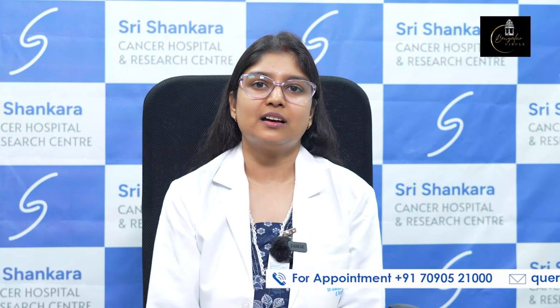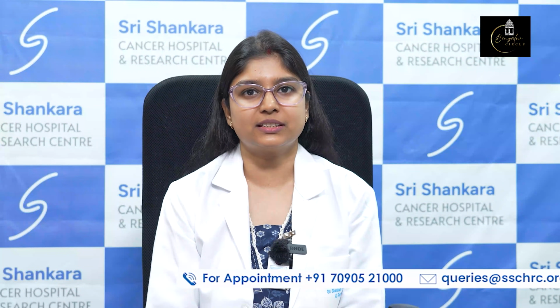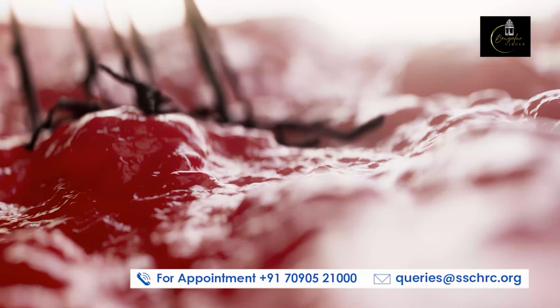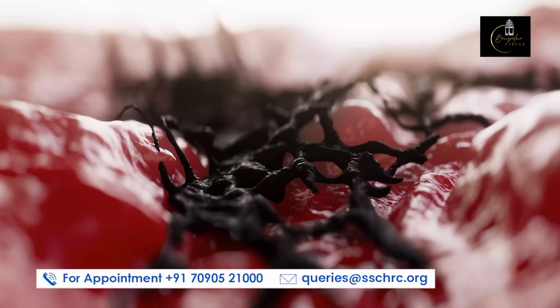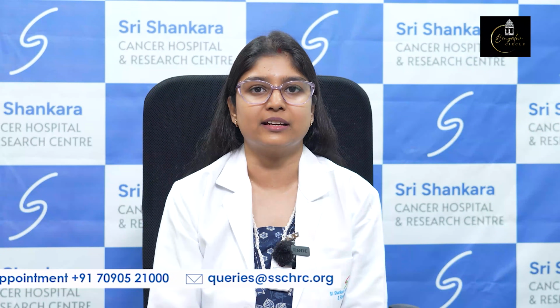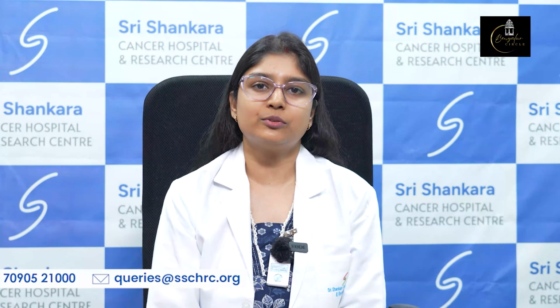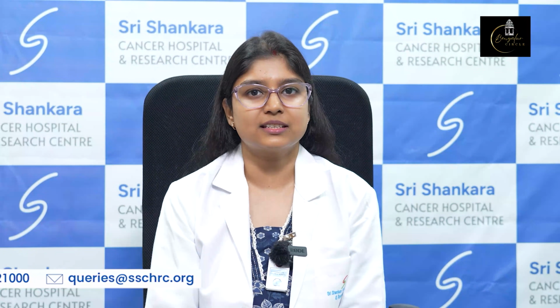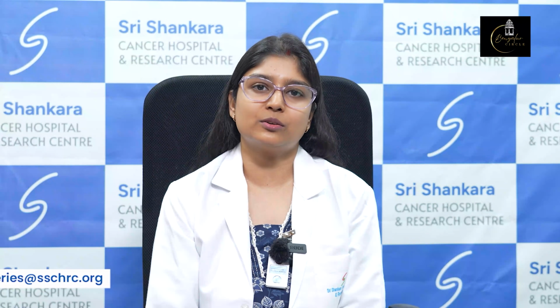In cancer patients, these PET-CT procedures are done at staging, that is, once the patient is diagnosed with cancer, to look at the disease spread, that is, whether it is at the local site or has gone to any other place other than the local site. So if it is metastatic or it is at a certain place, to know that, we usually do a staging PET-CT scan. Other than staging, it can also be used in patients who are undergoing treatment.